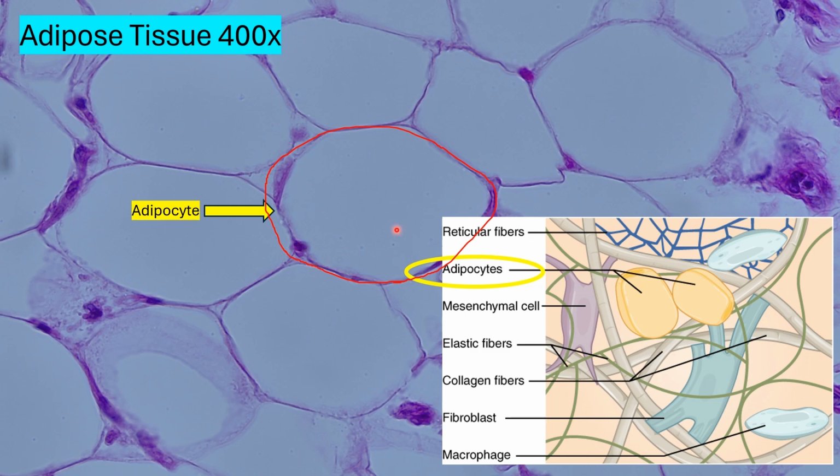Note that with most stains and fixing the slides with standard protocols, it actually dissolves the fat. So we're really just looking at an empty space on this slide right here with the plasma membrane and a nucleus. Also note that these cells are really 3D and spherical, so based upon where we cut this thin slice through the specimen, you might not actually see a nucleus in some cases, and it just looks like a circle where we can just see the plasma membrane.